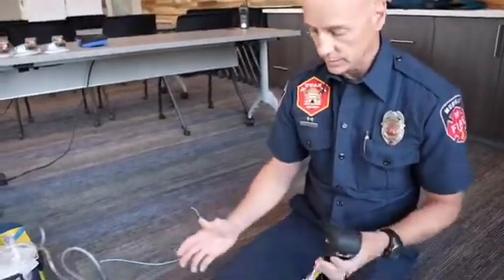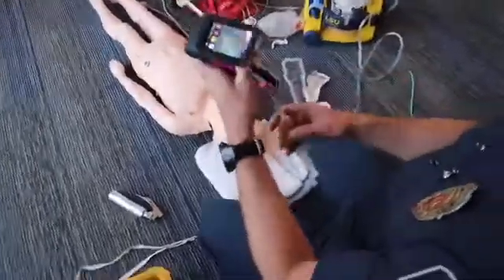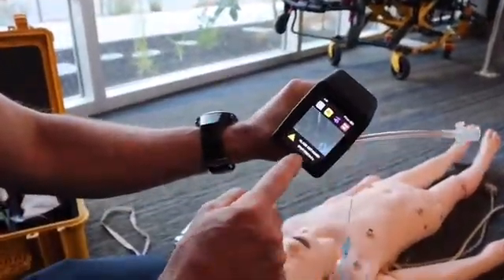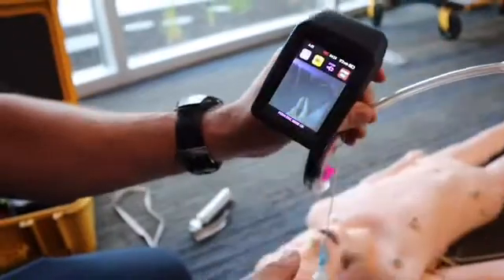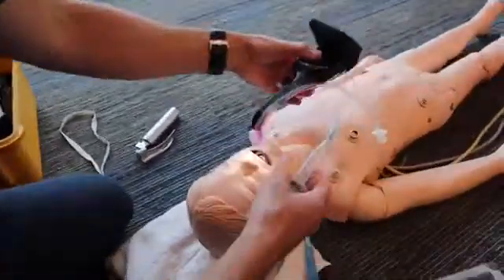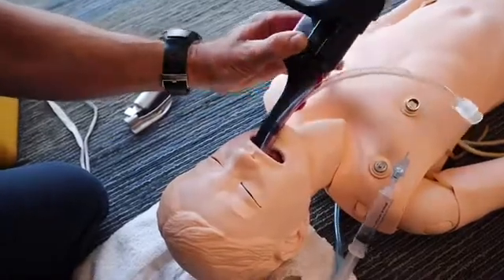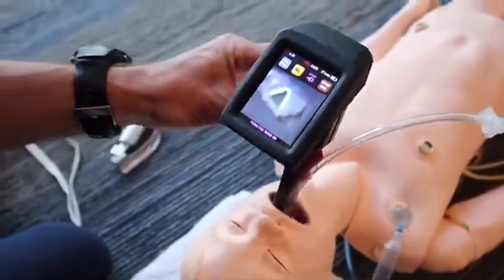Once everything is prepared — backup and all tools ready — direct your partner to stop ventilating and remove the OPA. The key to success with this device is finesse. You don't want to muscle it or grab hard around the handle because gripping too hard pushes the camera up off the blade and you lose your picture and recording. You only need three fingers to insert this. Start horizontally, put it into the patient's mouth, and follow the hard palate then the soft palate to the posterior oropharynx. Then simply tilt the blade back — you can see I'm using just two fingers — until you see the vocal cords.